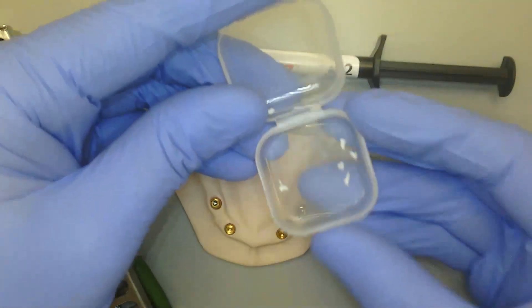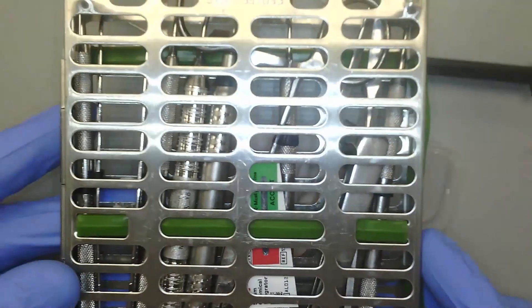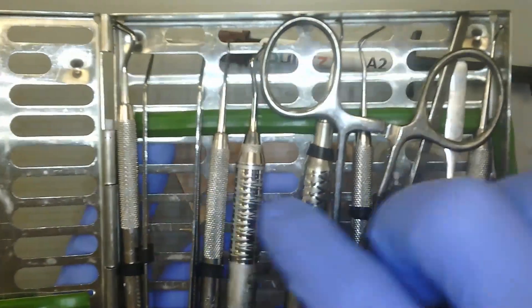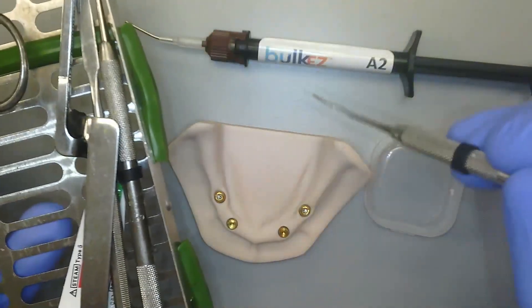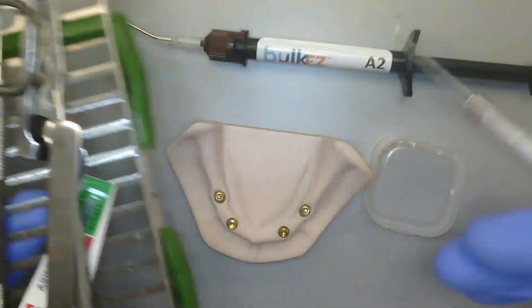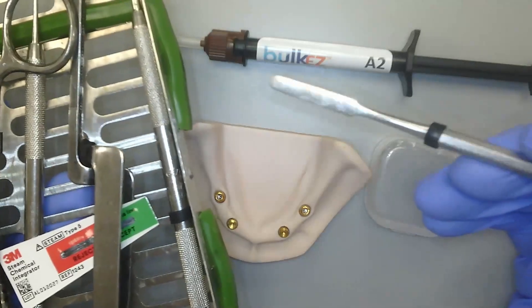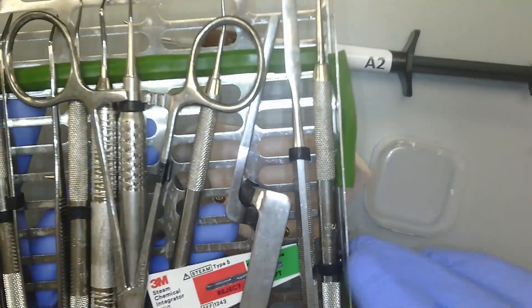Now, it doesn't need to be PTFE — it could be cotton pellets or something similar. We do want to place something that is very flexible over the top of the retaining screw prior to placing composite. Additionally, I have my crown seat kit. Inside, I've got a pickup cotton plier, a small condenser, a spoon excavator, a hemostat, a small scaler, a plastic instrument or spatula to smooth off the composite, articulating paper, a football condenser, a ball condenser, and a small spatula for mixing. This is my universal implant crown delivery kit.